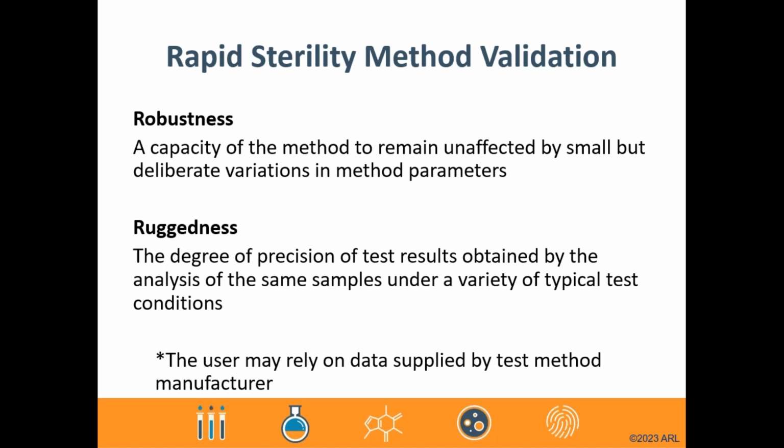normal usage. It's important to understand that the measure of robustness is not a comparison between the compendial and the alternative methods. Rather, it's a necessary component of the validation of the alternate test so that the user truly understands the limits of the operating parameters within that method.